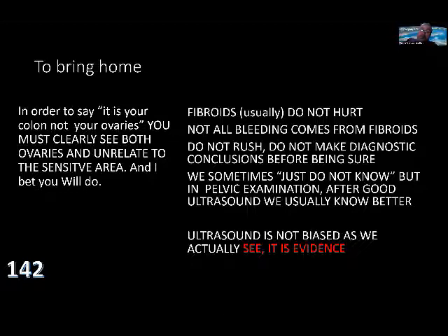But usually with ultrasound pelvic examinations, after a good ultrasound examination, we usually know better. It's not biased information. We are actually seeing inside. It's evidence. It's first-hand evidence.